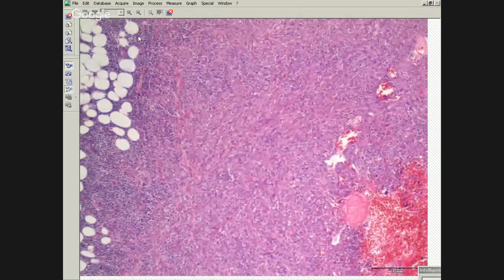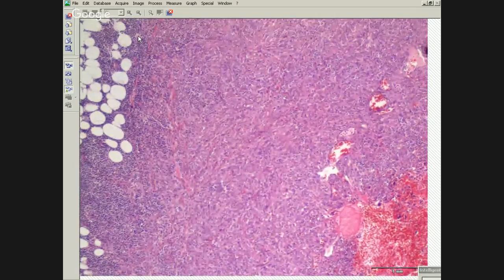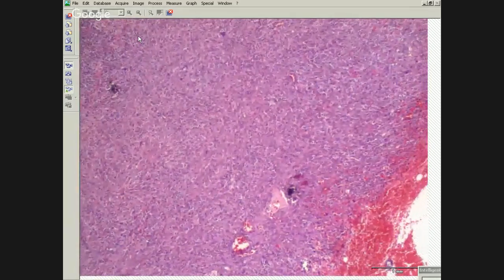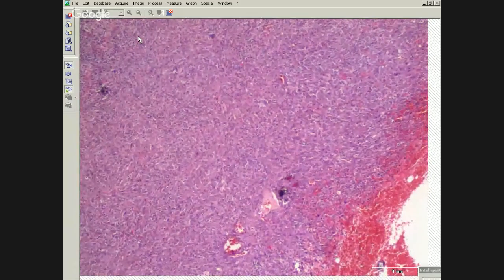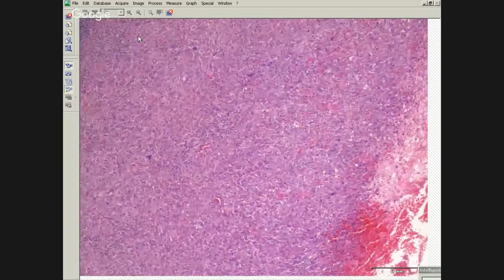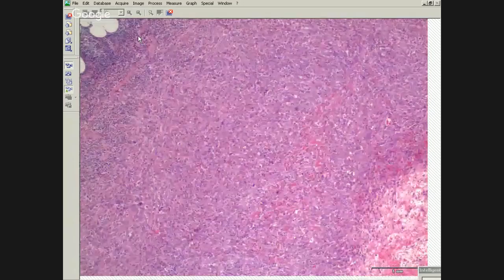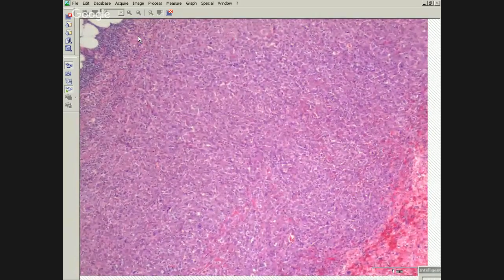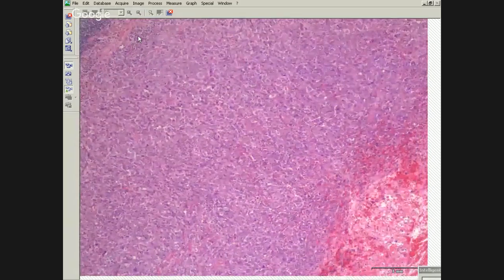So this guy, again, just has diffuse pleural thickening. He doesn't have any tumor anywhere else as far as we know. And he doesn't have an intraparenchymal lung mass. So it's pretty much just confined to that location. So you're right. So your main differential here is going to be mesothelioma versus a carcinoma.